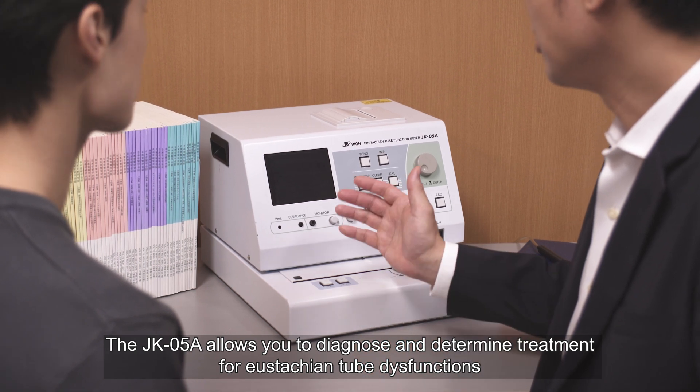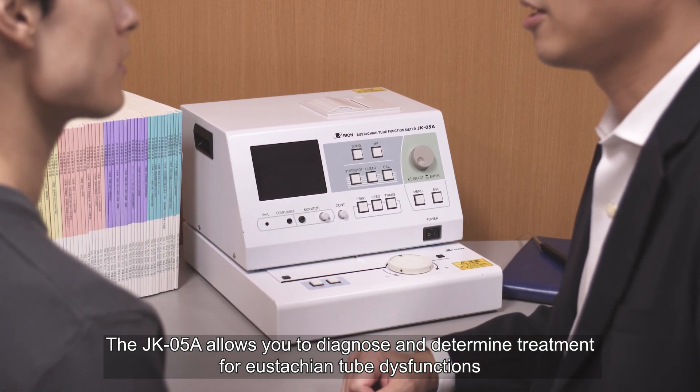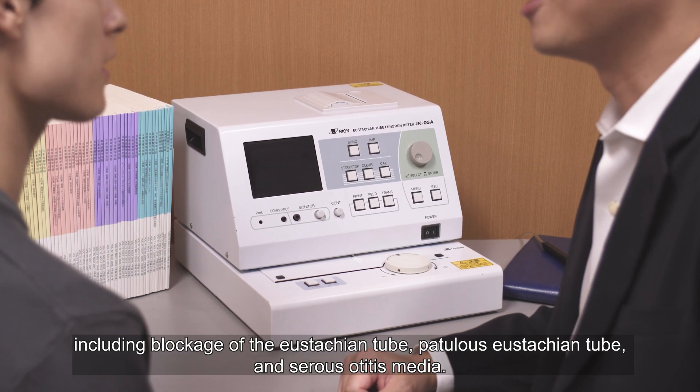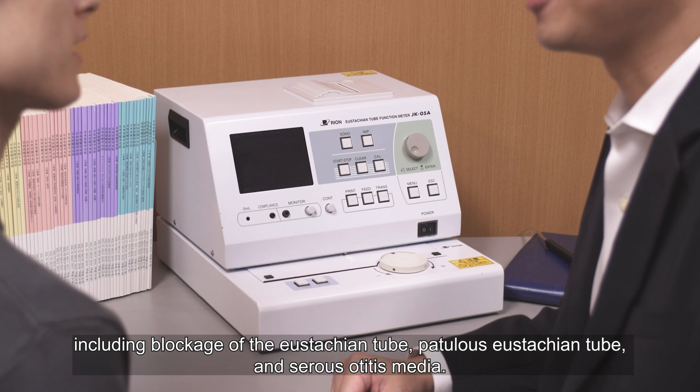The JK05A allows you to diagnose and determine treatment for eustachian tube dysfunctions, including blockage of the eustachian tube, patulous eustachian tube, and serous otitis media.